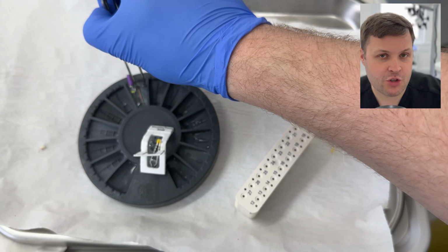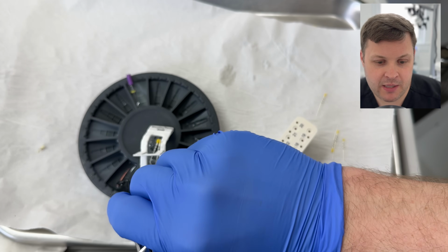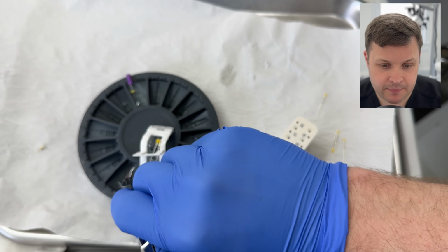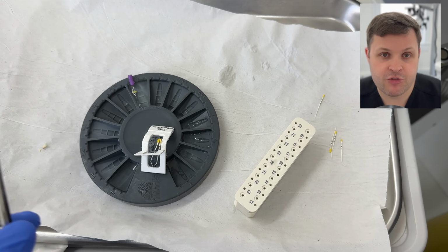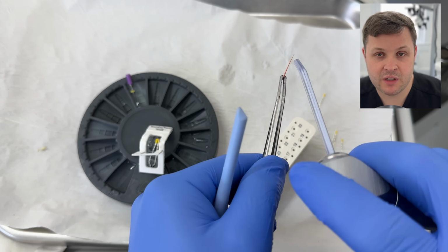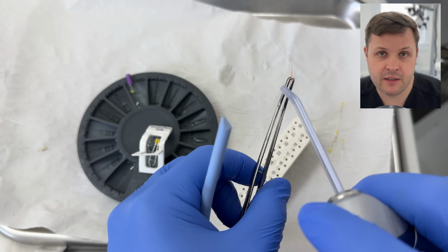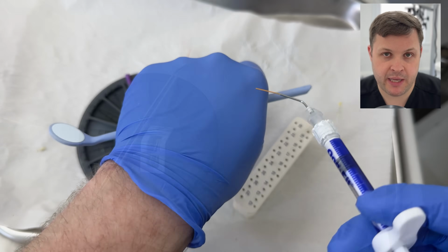And I want you to try and spot the mistake that I've done here. So I've picked up the GP cone from the buccal well, and then I'm going to dip it in some isopropyl alcohol. This removes the residue of the sodium hypochlorite, which apparently affects the obturation. And then we're going to place that to one side. That's ready to pick up.